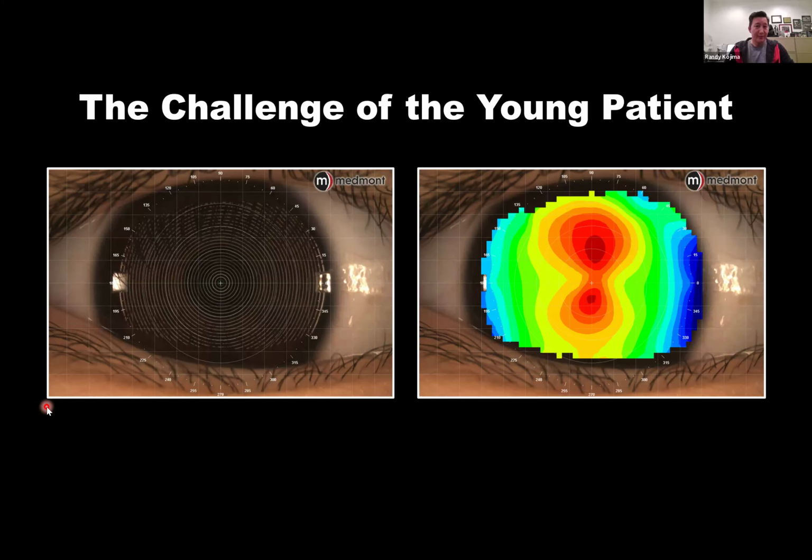In this case, this is actually my daughter, and she was 9 at the time, 9 years old, and she's of Asian descent, so her fissure size is kind of small. En este caso, la captura es de la hija de Randy, 9 años en el momento de la captura, obviamente de raza asiática, y como pueden ver, la formita de los ojos es un poquito más estrechita y a veces se hace un poco difícil poder tomar la captura.